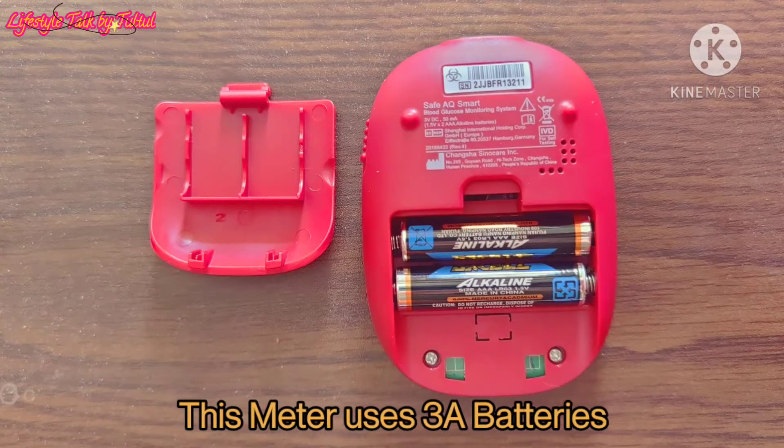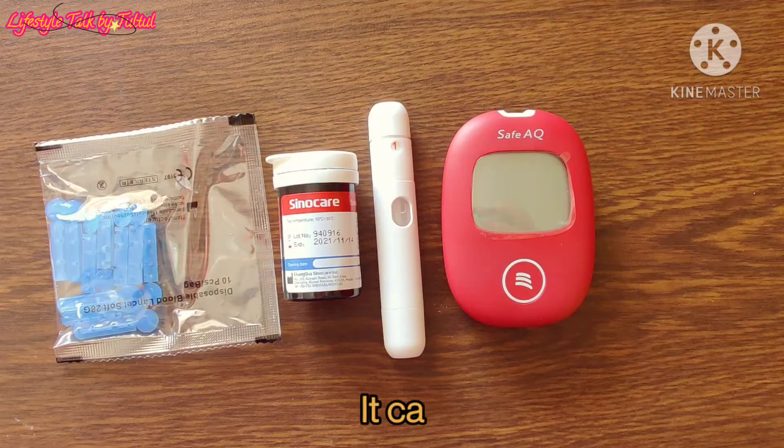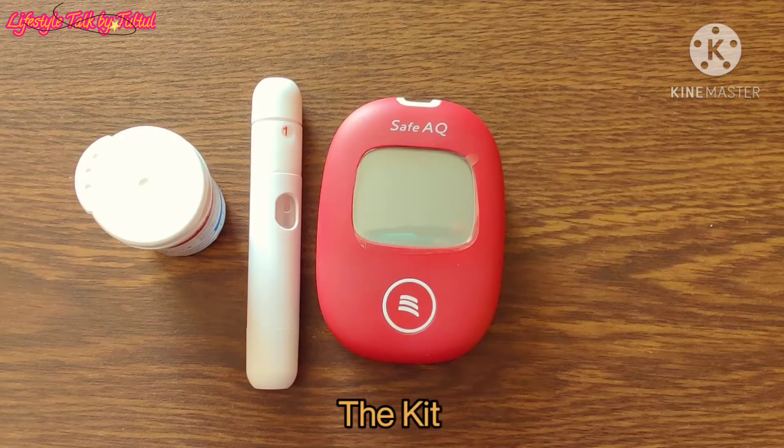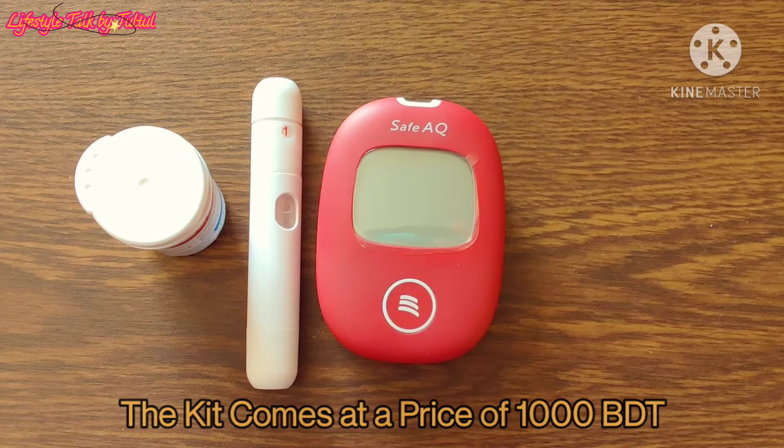This meter uses 3A batteries. It can be used about 1000 times. The kit comes at a price of 1000 BDT.